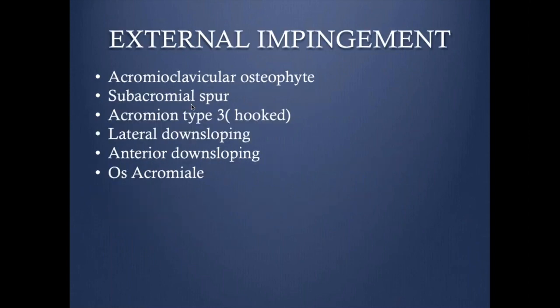Let's look at some causes of external impingement. We're going to look at the acromiohumeral interval and the acromioclavicular joint to see what can cause impingement on the rotator cuff between the acromion and the humeral head. Causes include acromioclavicular joint osteophyte, subacromial spur, acromion type or shape, lateral or anterior downsloping of the acromion, and os acromiale. I'll discuss each one with examples.